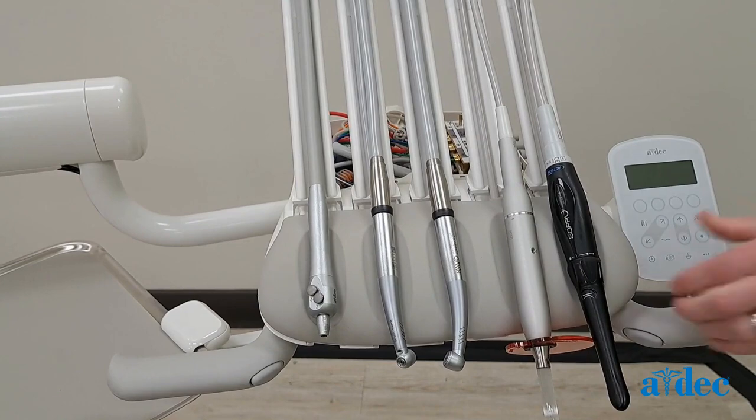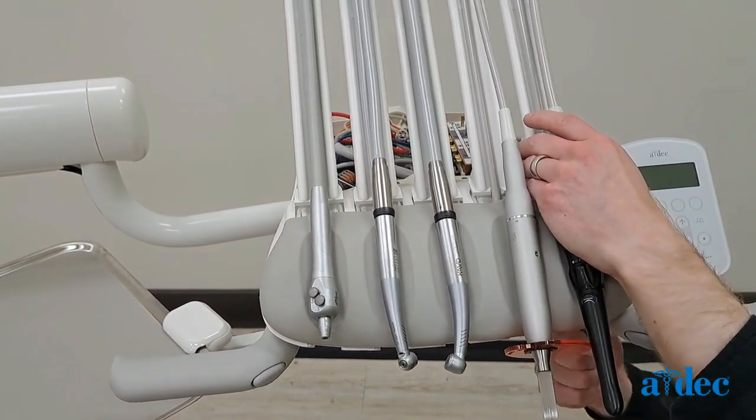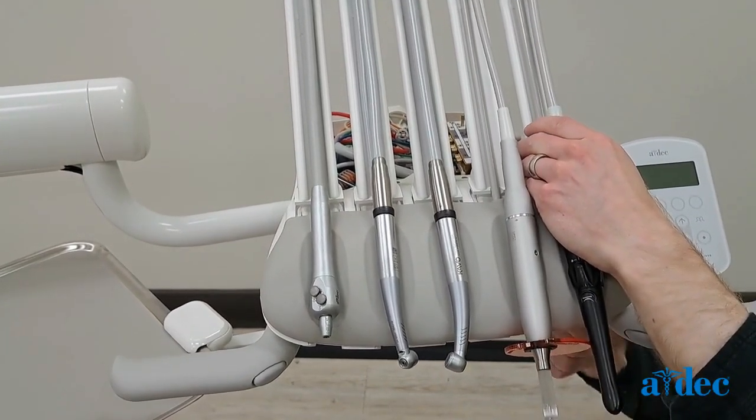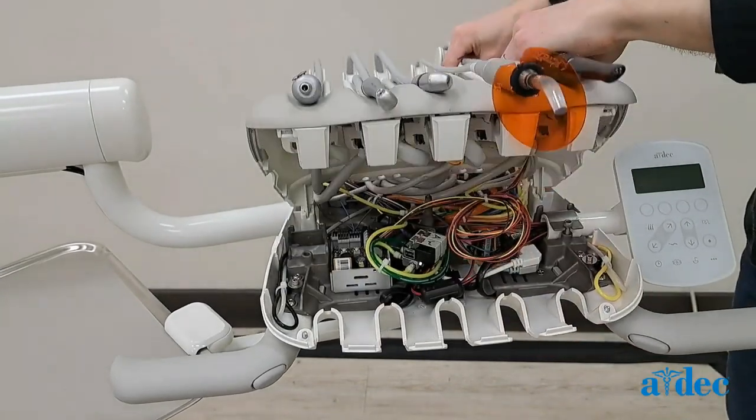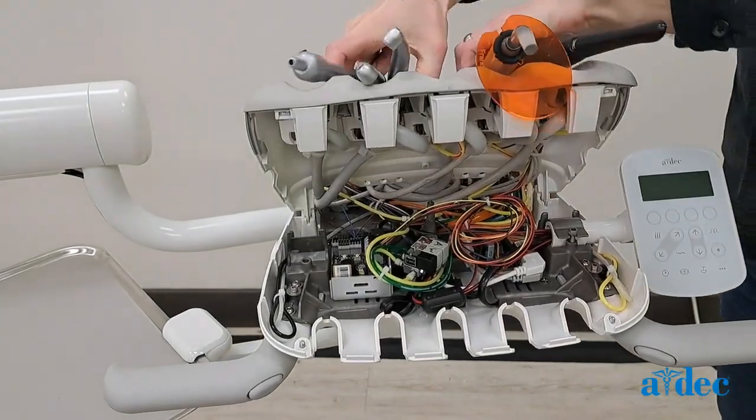Once the rear cover is removed, lift the front cover by removing the 2 screws on the underside of the front of the unit. Note, the front cover may tip back on its own due to the weight of the whips and tubings. Take care to hold the cover in place while removing the screws.